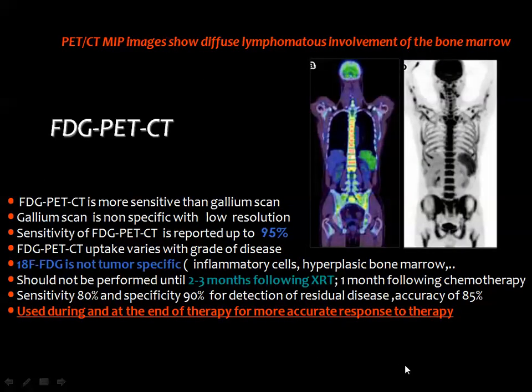And the issue of PET-CT in the evaluation of bone malignancies is somewhat debated. The literature considered PET-CT more sensitive, of course, than gallium scan.